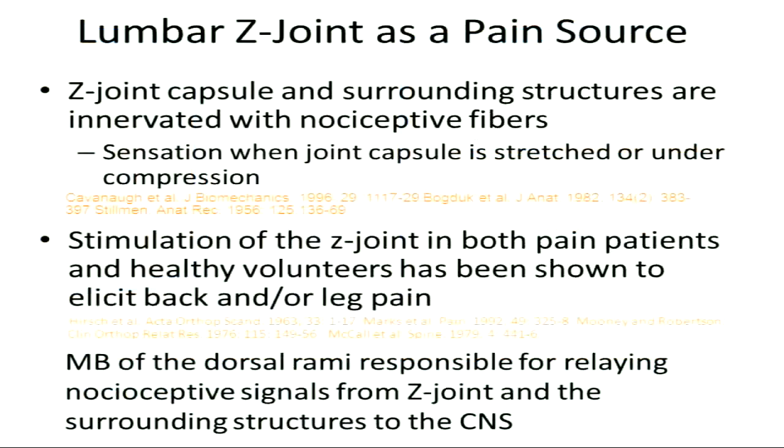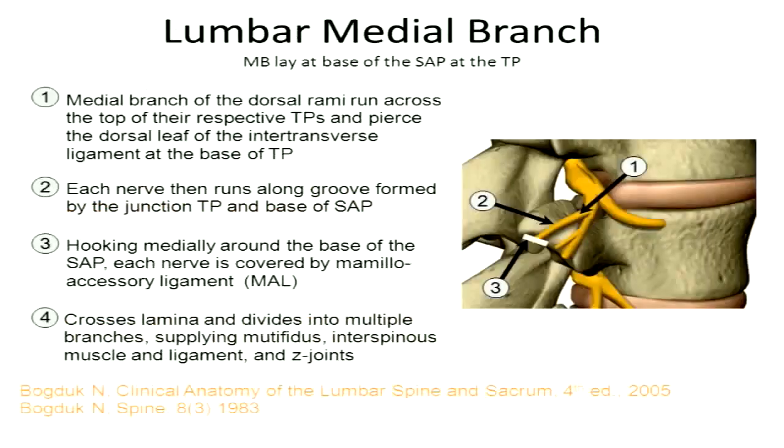The nociceptive input for the Z-joints comes from the medial branch of the dorsal rami, and we've established that. We've all done lots of medial branch blocks to prove that the pain is facetogenic in nature.